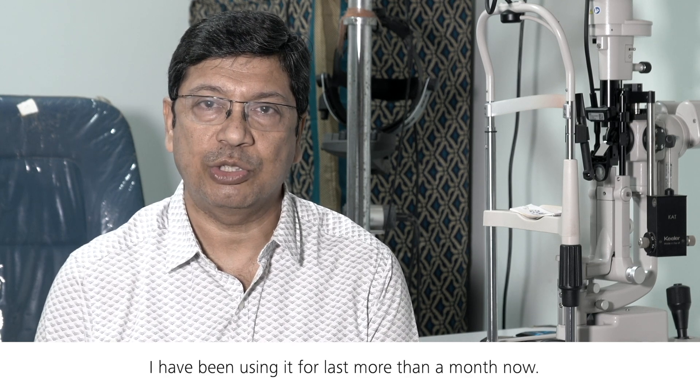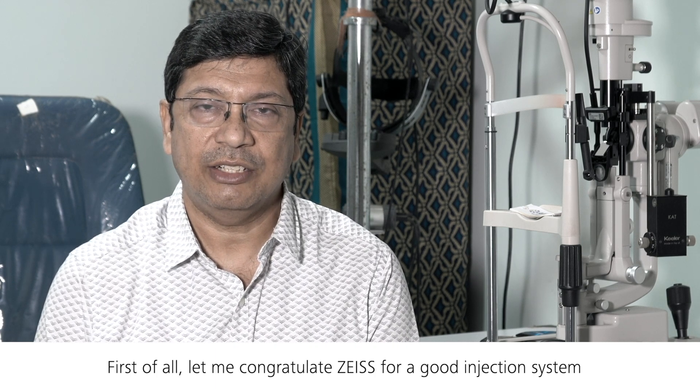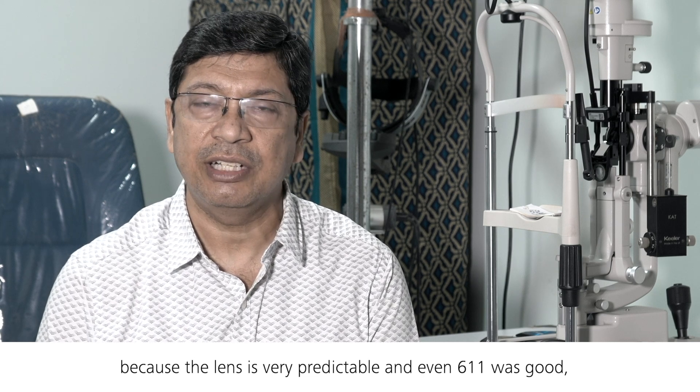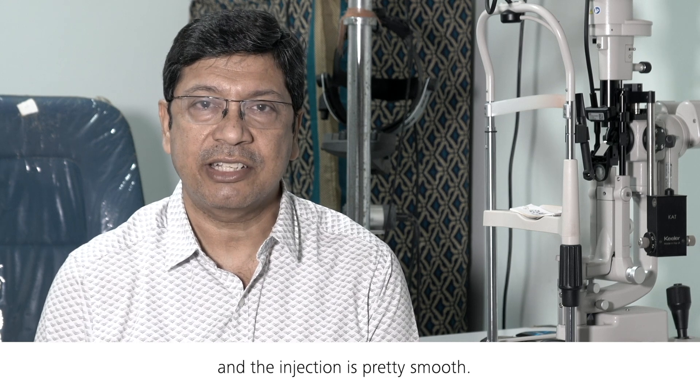I have been using it for more than a month now. First of all, let me congratulate Zeiss for a good injection system, because the lens is very predictable. Even the 611P was good, and this has been a little more modified version of that, and the injection is pretty smooth.